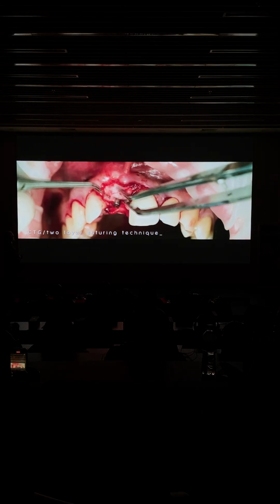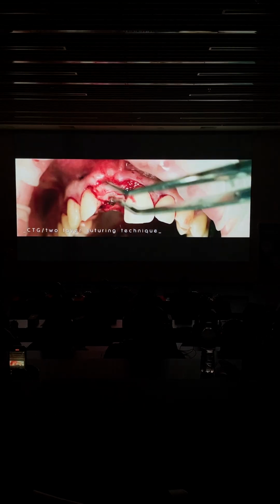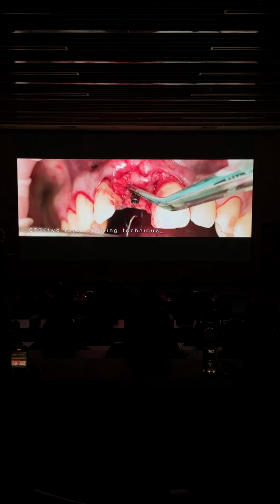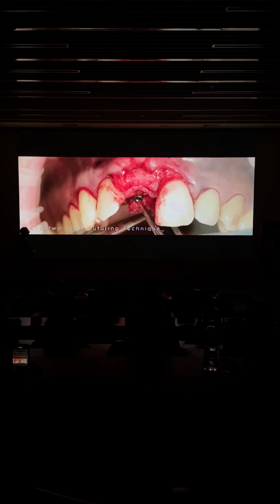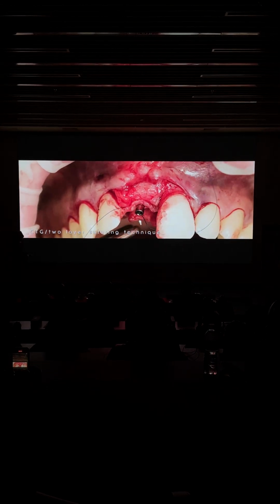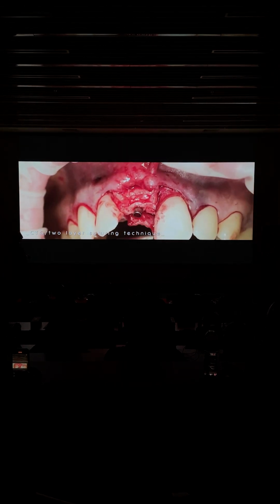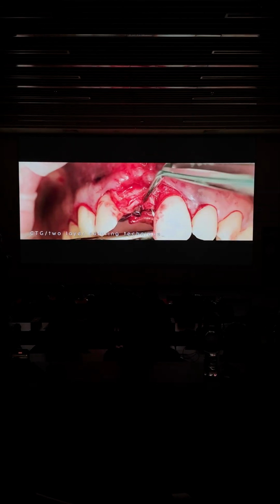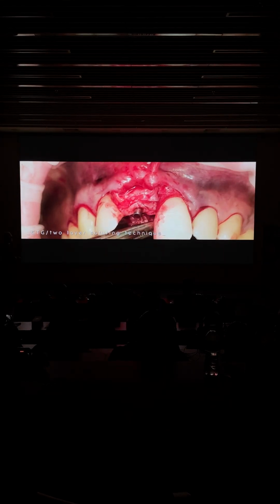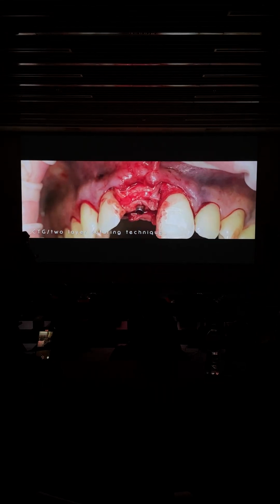everything has been elevated partial thickness flap. I don't do vertical releasing incisions, so that means I have to go at least 1 to 1.5 sideways in order to overcome the volume that I want to improve crestally. And what I do is I suture the connective tissue to the buccal and palatal flap. And what we want is to stabilize, like everything we do in surgery. It needs to be stable, non-movable.